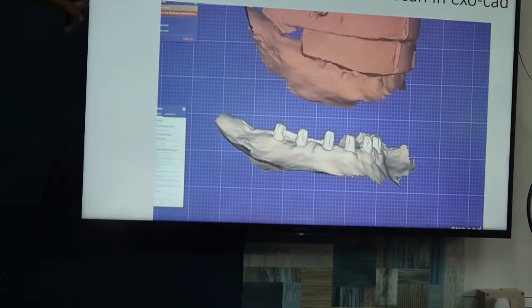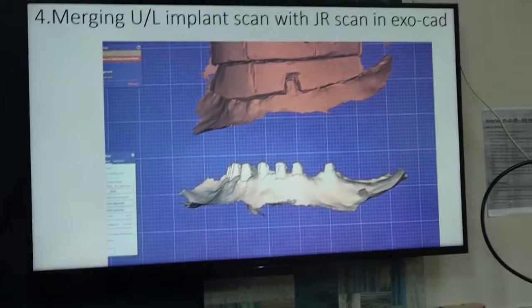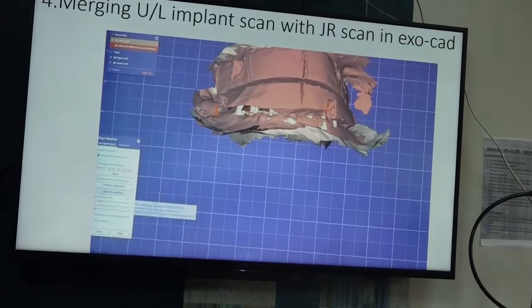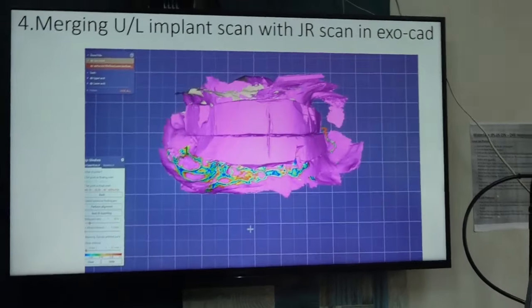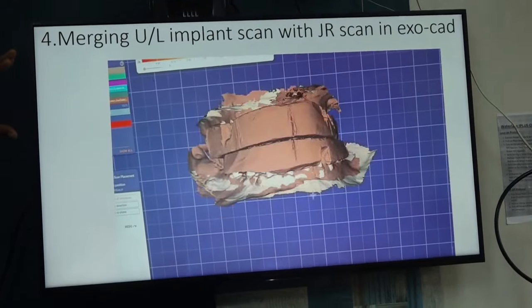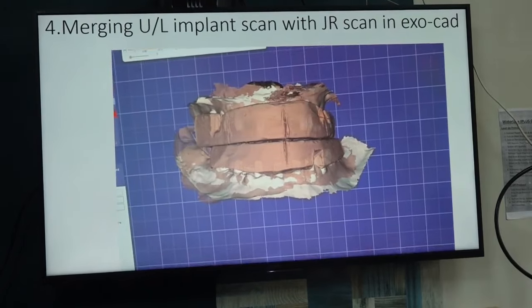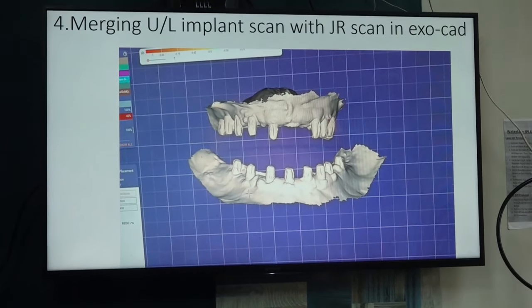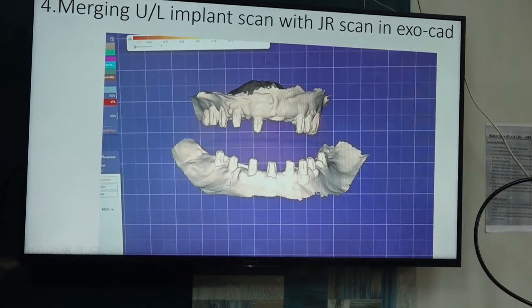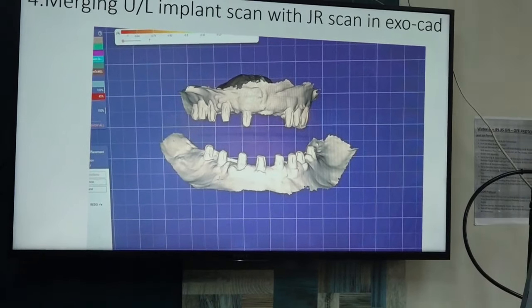First she is merging the upper implant scan with the upper bite rim, right? Then lower implant scan with the lower bite rim. That's it, no? See. Now they are in the correct VD. Okay, the articulation is done. So here also errors can happen. If you have fixed landmarks, if they are given, then it is easy to do the articulation properly.